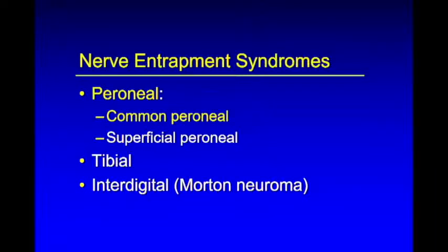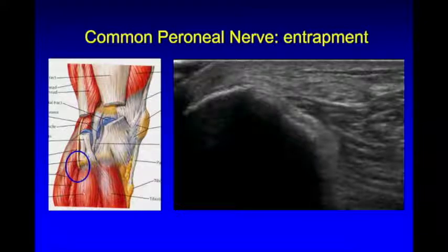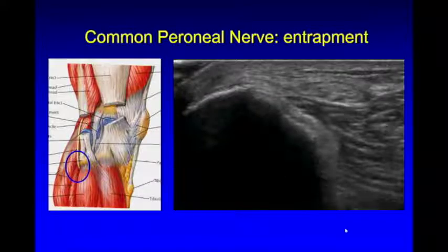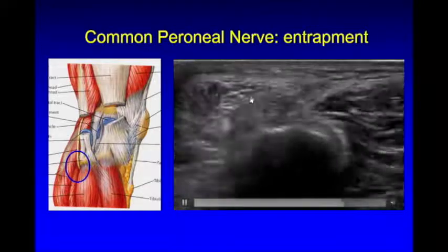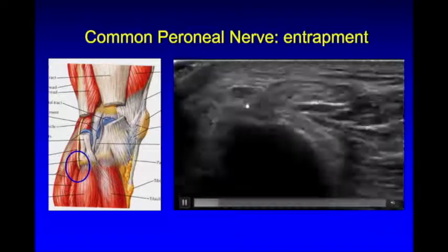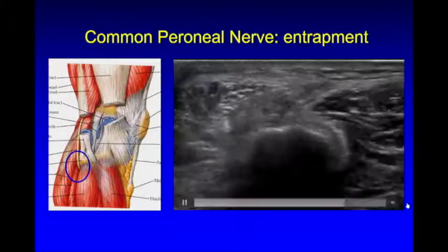Wrapping up with the lower extremity, beginning with the common peroneal nerve. We see this nerve paralleling the biceps femoris as it goes into a tunnel underneath the peroneus longus muscle — also prone to injury from fibular fracture. Here's the nerve, and as we move distally we see it get enlarged as it tries to fit underneath the peroneus longus muscle, becoming hypoechoic. Pushing on this induced symptoms.